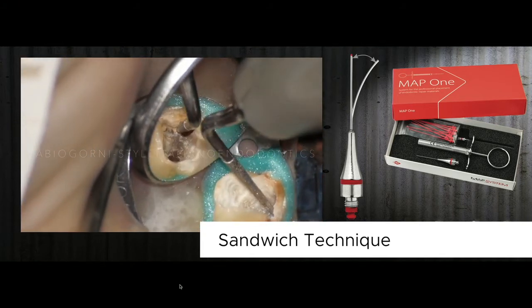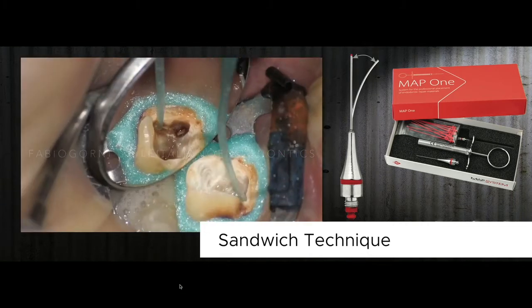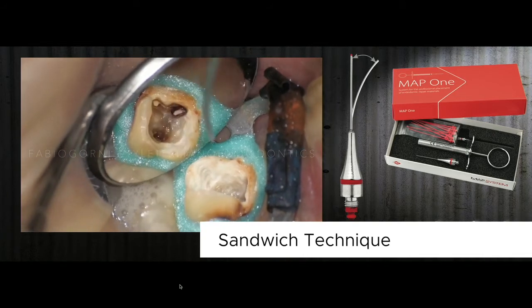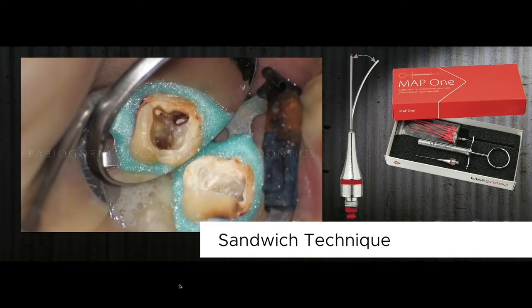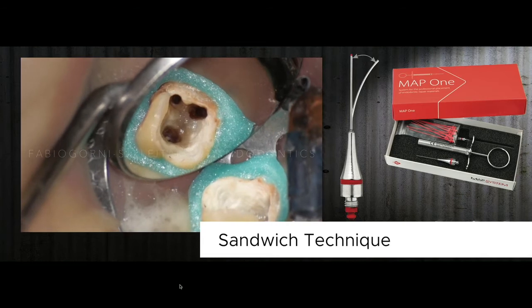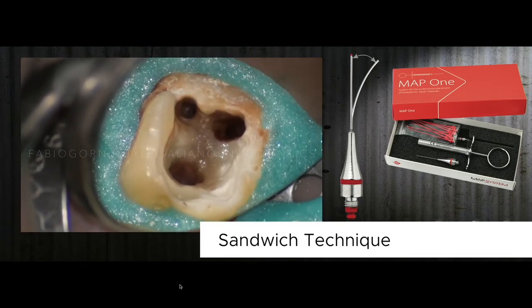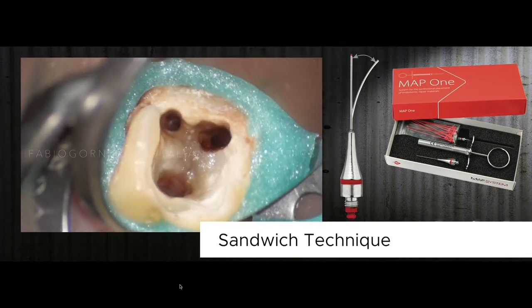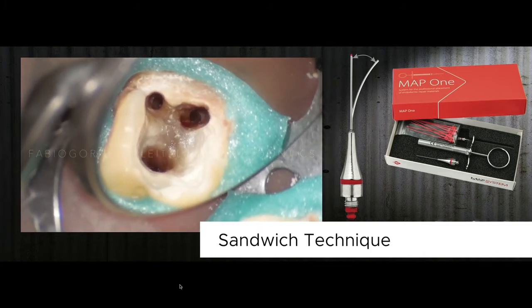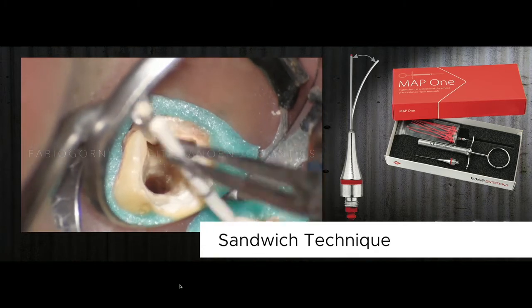So that's why now, if we want to treat the system before the repair of the perforation, we have to make two different actions. First, we have to remove all the gutta percha from the canals and then clean, shape, and pack the root canal system. And after that, we will repair the perforation. So that's why we are talking about sandwich technique. Also in this case, the control of the exudation is perfect. Of course, using the microscope, we can control that area much better. So that's why the use of the microscope is absolutely indicated.